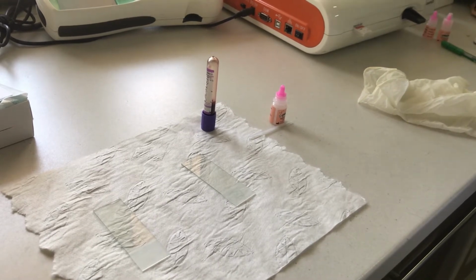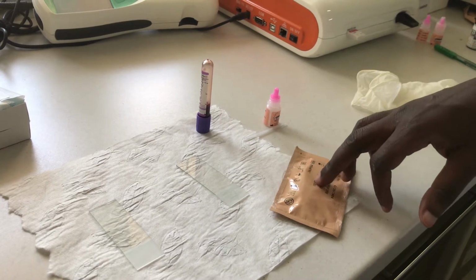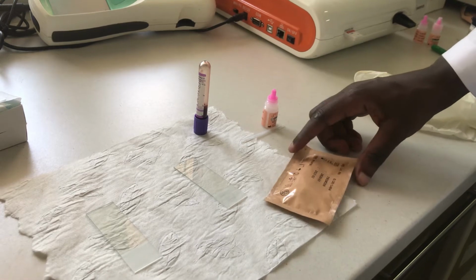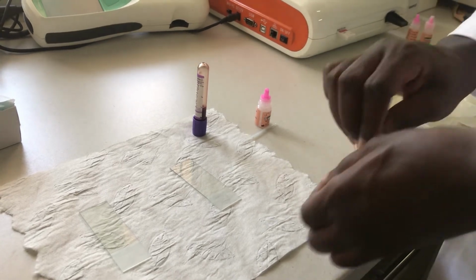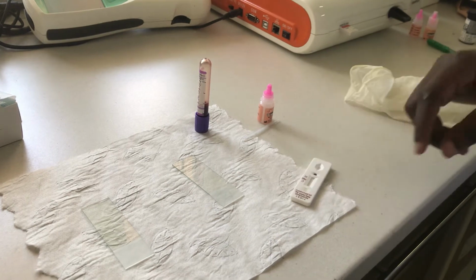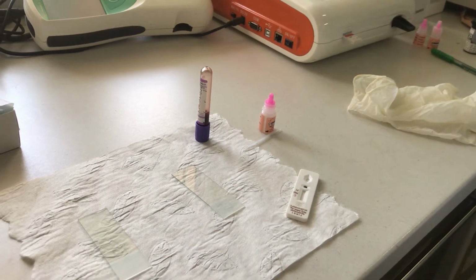One of them is using a rapid diagnostic kit, which is called a malaria RDT, a rapid diagnostic test. This is a test kit which has a cassette inside, and you're able to run your blood sample through it.